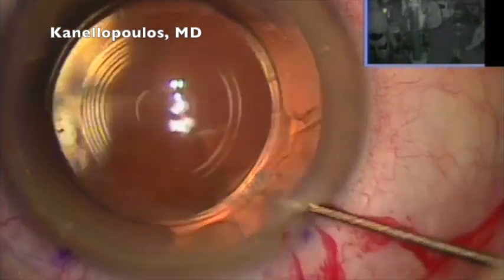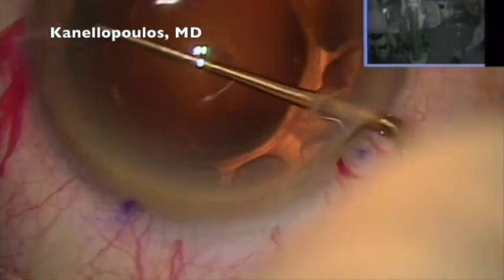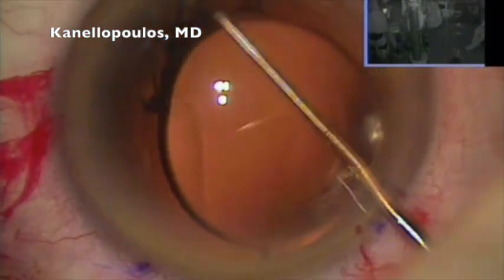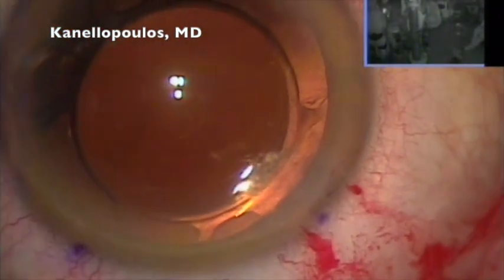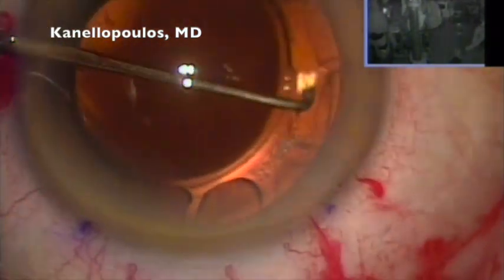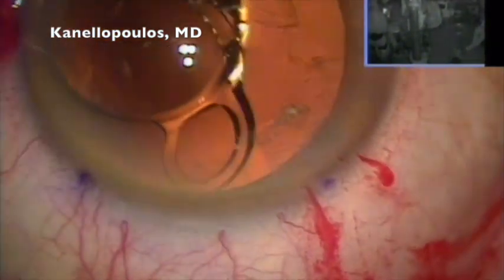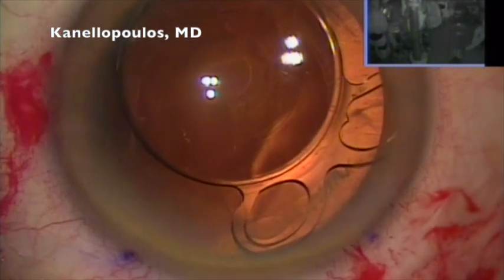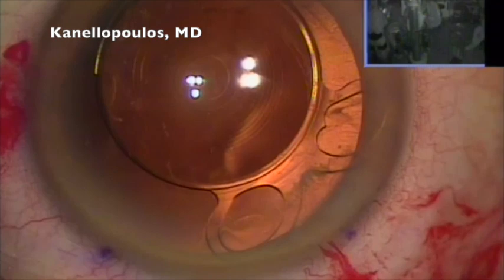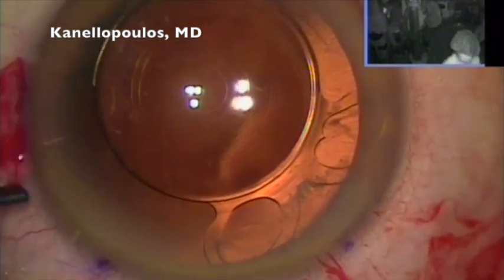As you can see here, we're seeing a wave of viscoelastic, and then I'm using my Sinskey hook to pull the two haptics out of the capsule bag. And fortunately, this is going very well. Sometimes at 2.5 months, especially in our patients here in Greece, this is very difficult. And now all haptics are released, and I will bisect the lens.